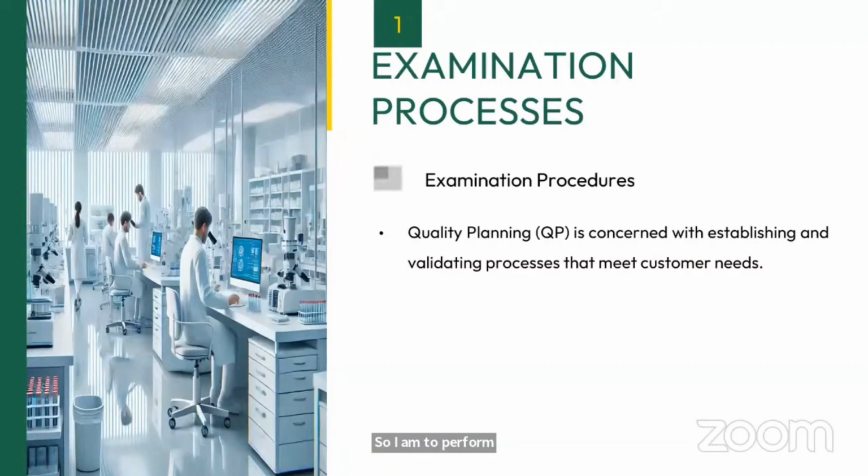So I have told you three conditions when you have to perform the validation. And verification, yes, everybody has to do when starting a new test in your laboratory. So if you want to start thyroid tests in your laboratory, T3, T4, TSH, which are well validated, but for the first time you are introducing them in your laboratory, start with the verification. Verification, everybody has to do. Validation, there are only three conditions when you have to perform it. Are we clear with verification and validation? That's it.